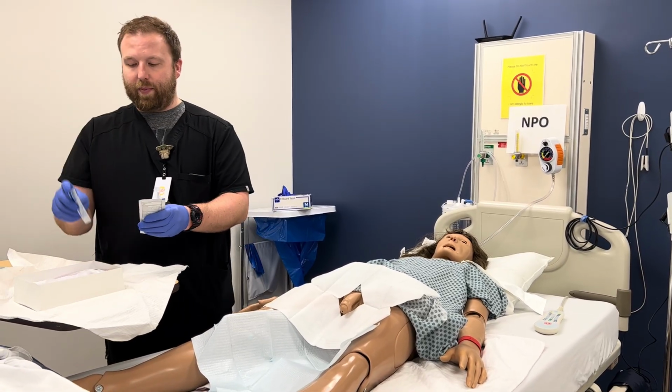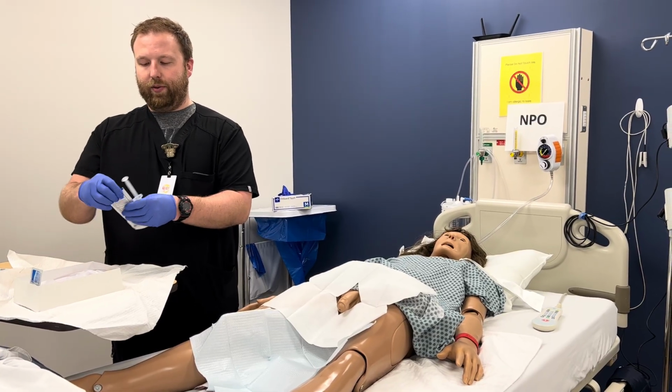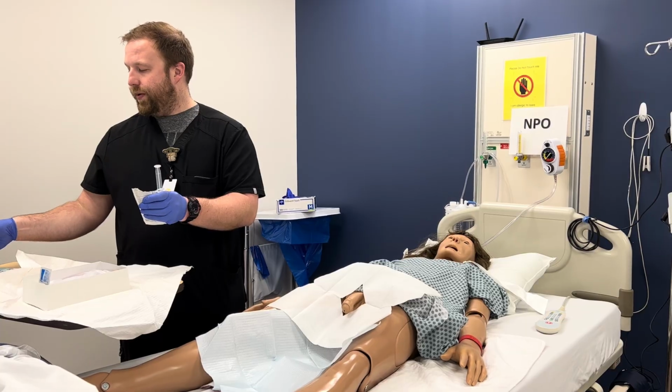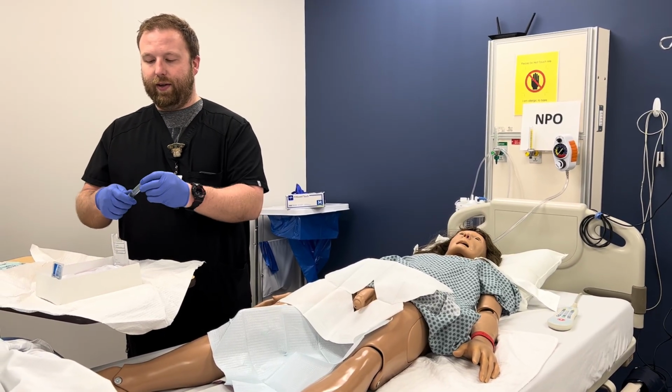I want to open up my lubricating pack. I would put it down here. I'm going to open up my alcohol swabs, place it at the bottom here.